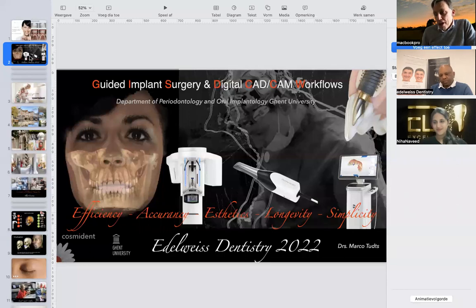If you have an Edelweiss crown opposed by an implant crown in zirconium, for example, the Edelweiss crown will wear out a little bit, but the good thing about the block is that even if it wears out, it stays very polished, because the more you polish it with your toothbrush and toothpaste, or with your own teeth, the more glaze it gets. That's a good thing.